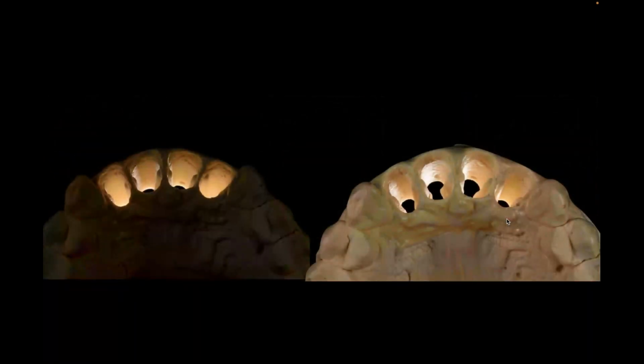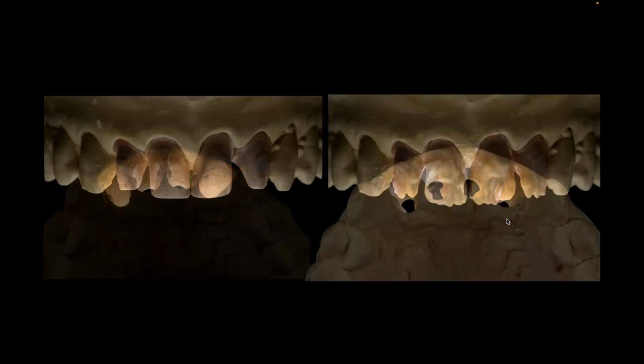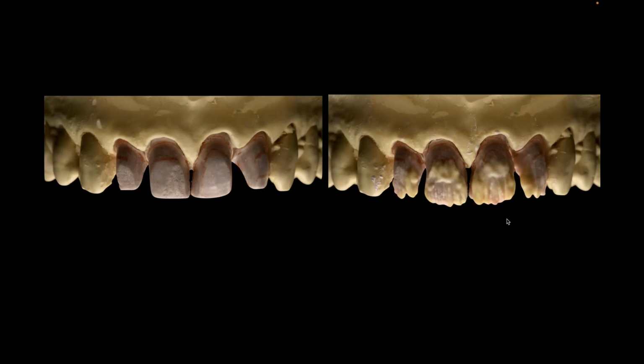We wax and provisionalize. I'm going with the refractory case here. And Jim, I didn't forget you asked me something about refractories. I will send you those slides. I'm using an alveolar cast, which Abraham here in my office spends so much time getting ideal and perfect. And on these alveolar casts, we have removable dies that can be a solid stone die or a refractory die. In this case, I'm going refractory.